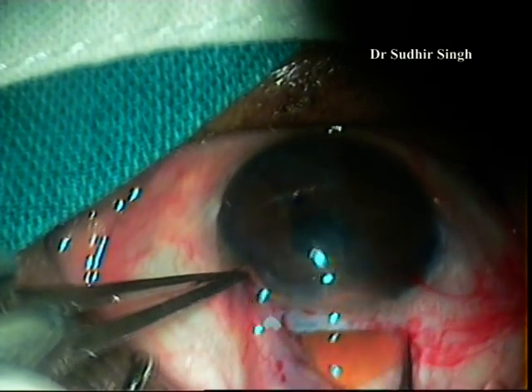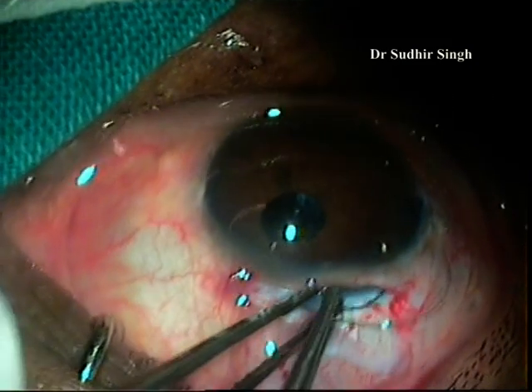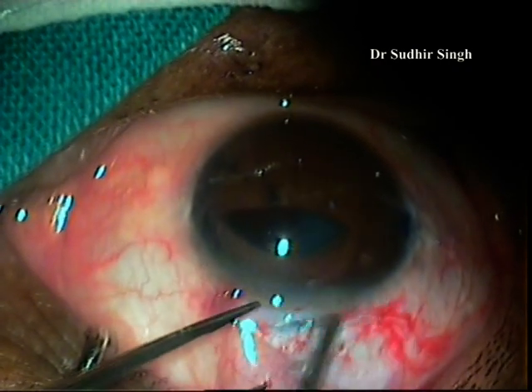The small nucleus is taken out by the vectis. A six millimeters PMMA IOL is implanted.